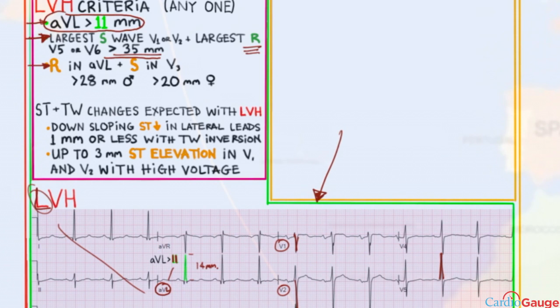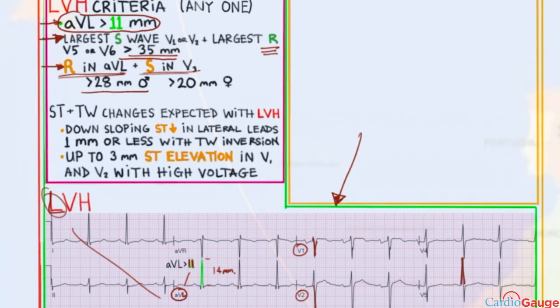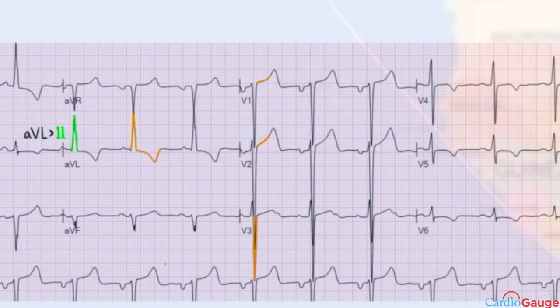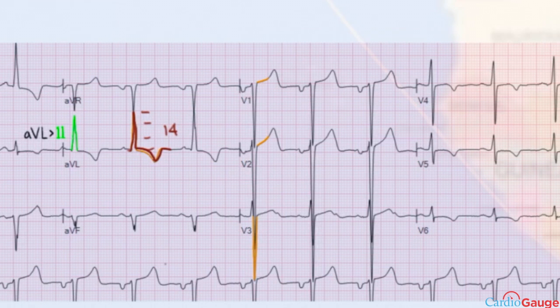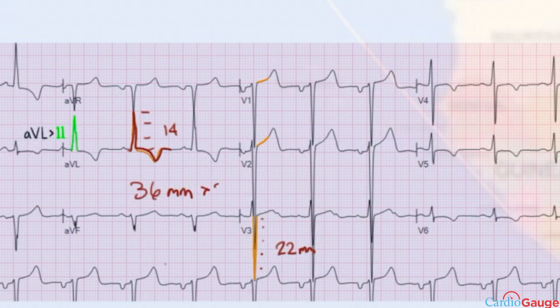The last criterion is R in AVL plus S in V3, greater than 28 millimeters in males and greater than 20 millimeters in females. The R in AVL measures about 14 millimeters, and the S wave in V3 measures about 22 millimeters, giving a total of 36 millimeters — which is greater than 28. So we have LVH by that criterion as well.